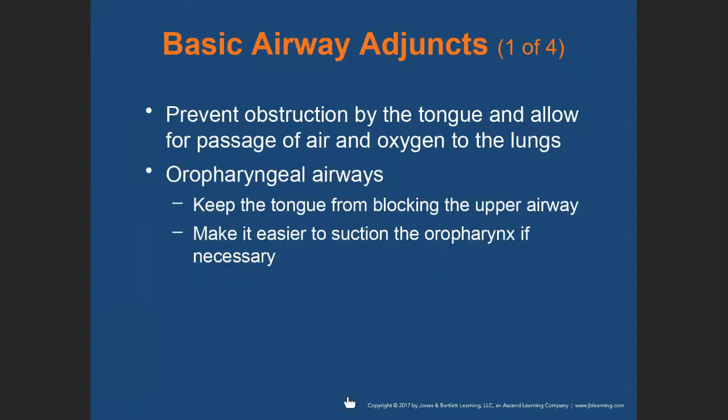All right, so that's suctioning. Now let's look at basic airway adjuncts. A lot of people in the medical field are familiar with airway adjuncts but don't know how to use them properly. When I say don't know how to use them properly, I mean they might know to measure and put it in, but that doesn't mean that you can use a device properly. So if you don't know when a device is needed, you cannot use it properly. It doesn't make sense. You can put in an airway adjunct, but you don't know how to assess a patient and determine when it is required. You need to know when it is required, and you need to understand why you're using it.